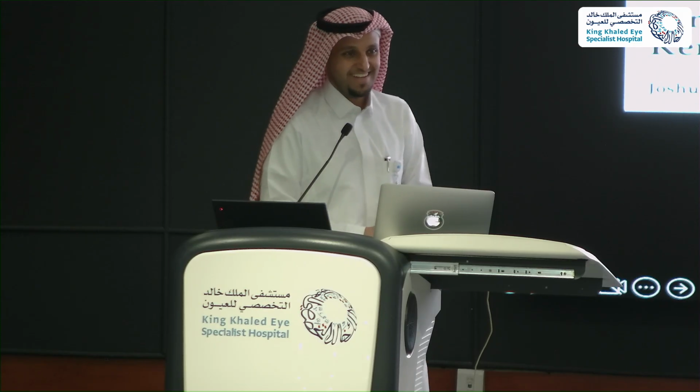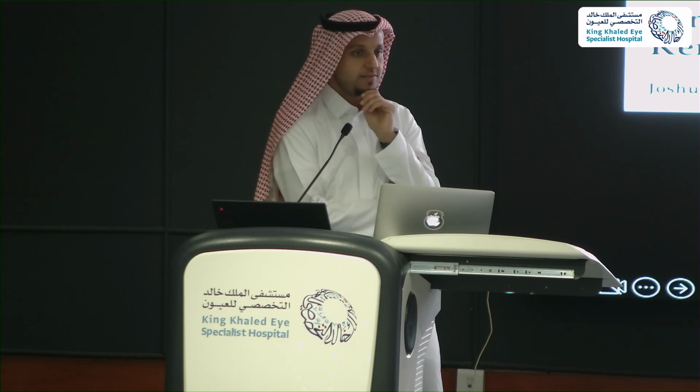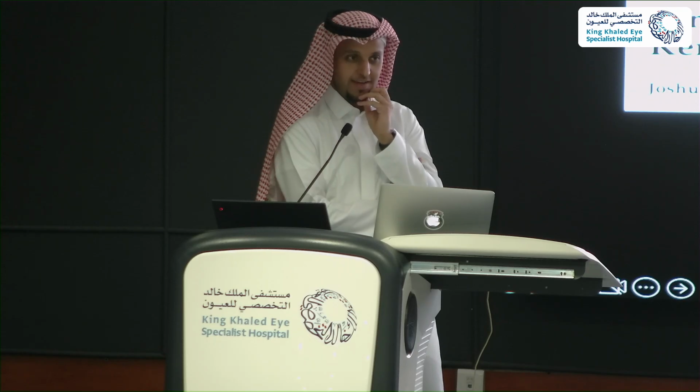Thank you very much. But you know what? I encourage people doing surgery with the least possible equipment. So when I do the lamellar, I use a 57 blade and 0.12 and the patient.